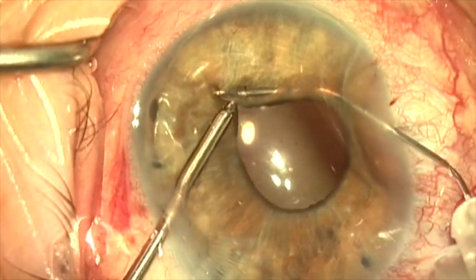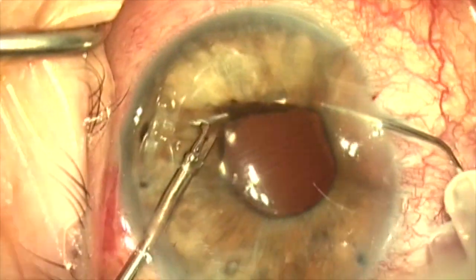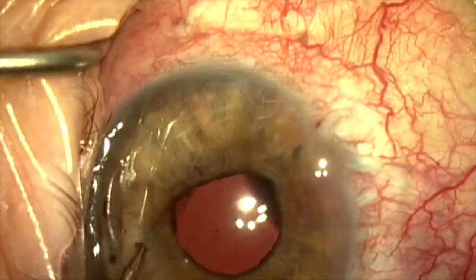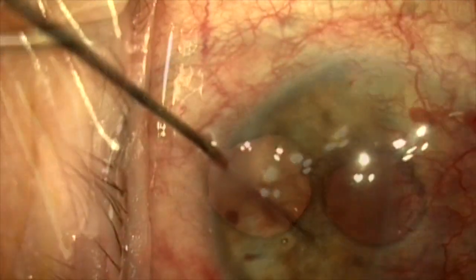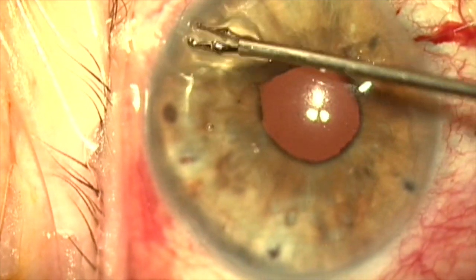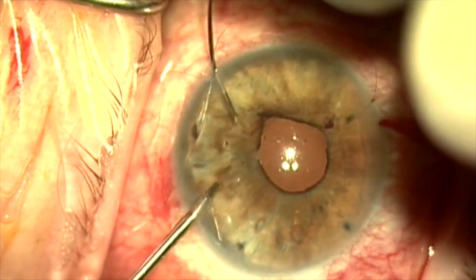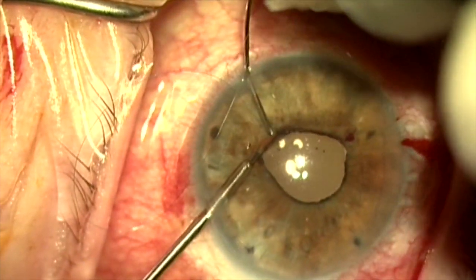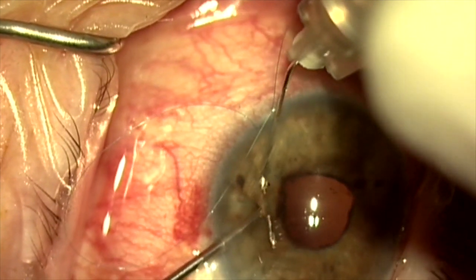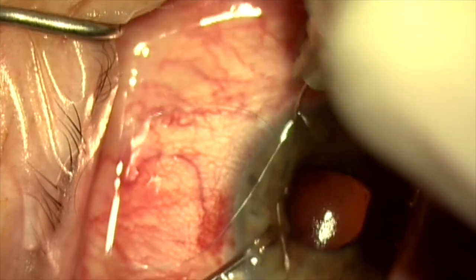All my passes will be a running mattress suture using the 33-gauge needle about one to one and a half millimeters behind the iris sphincter. Here I'm grabbing the 10-0 prolene suture and pulling it out of the lumen of my 33-gauge needle. I'll now loop this suture out of the paracentesis to continue the cerclage, reload it into the needle, and reenter, stabilizing the iris with my left hand while passing the suture through the iris at about one millimeter posterior to the pupil margin.